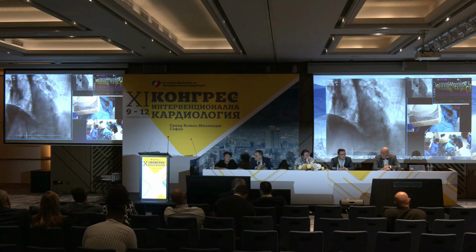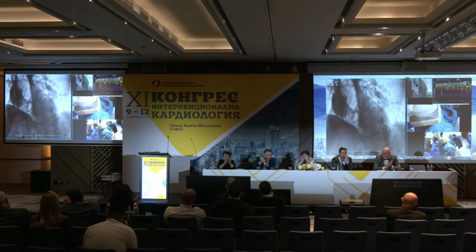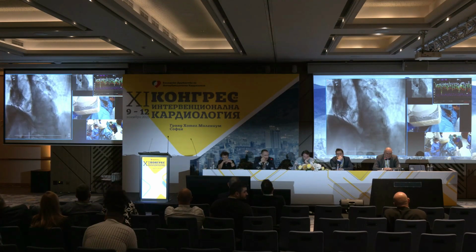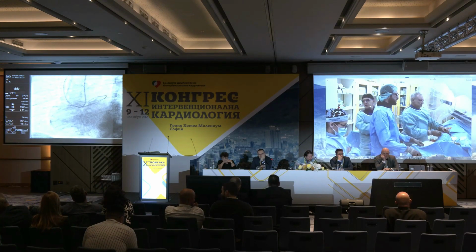Okay. So excellent case. Thank you so much. Thank you. Congratulations. So let's go back to Kuda. Live. Yes, you're live. Contrast.